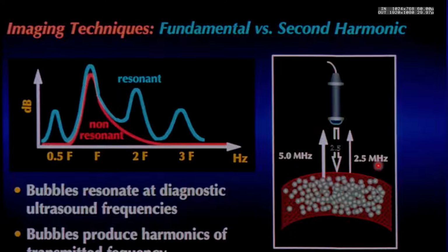And people have discovered that these microbubbles resonate, okay? So just imagine I have this tiny microbubble, I hit it with some ultrasound frequency, and it sends multiples of that frequency back. It resonates differently. I'll give you an example. If you're an instrument player, either piano or string instrument, if you hit it with a not too hard stroke, it's going to emit that frequency, whatever it is, C, G, whatever.